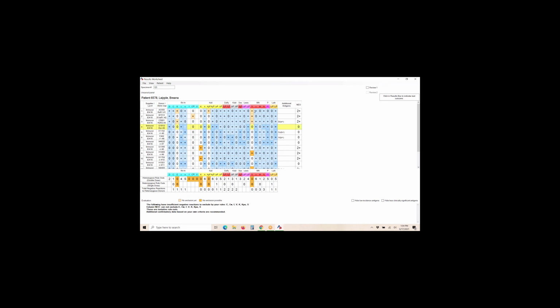And then, the question always comes up, and we'll go through it. Why up here is the S not? If it's only looking like an E and a K are the 2 main ones that are dark orange over here and over here, why aren't these? Well, this S isn't coming up because KPA isn't excluded, and neither is E. This one because CW is not excluded. This one because E is not excluded, etc.